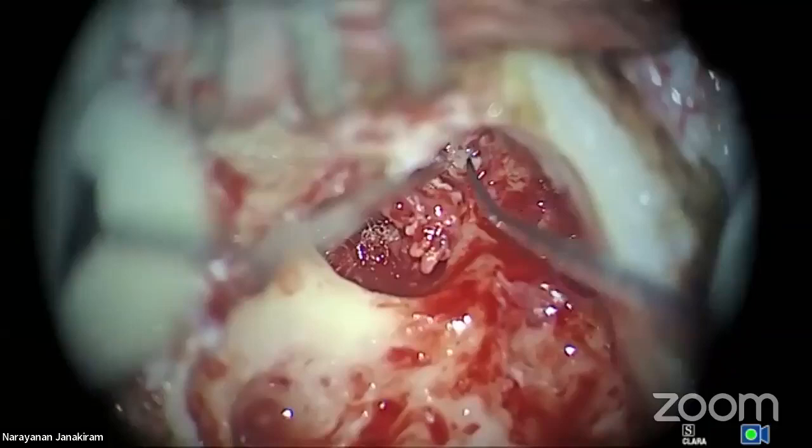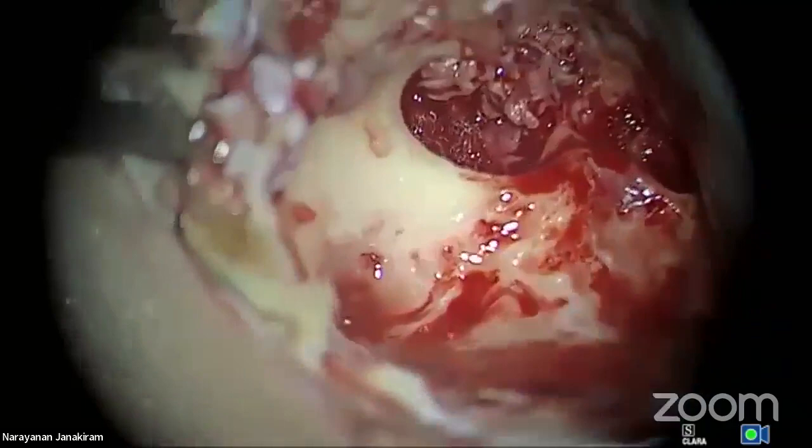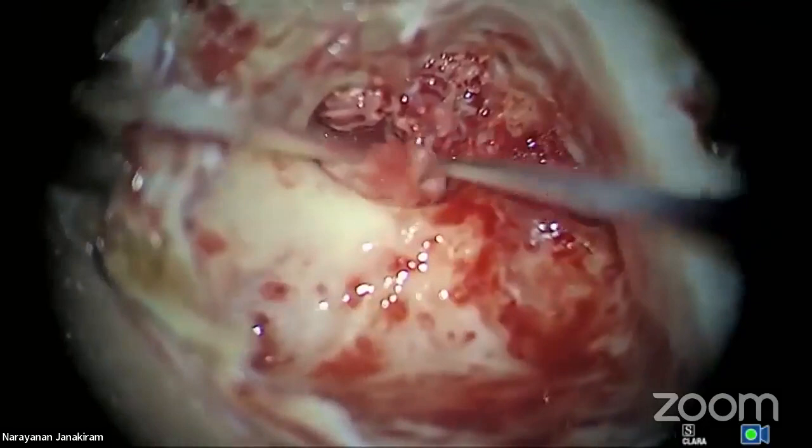See here, I'm opening up the anterior epitympanum. You understand, that's the anterior epitympanum. Can you see here? Now, what I'm going to do, now you go towards, away from you, scissors, give me a cotton ball. I'll place the cotton ball over the foot plate. Normal saline. Okay, good. That's just a normal saline cotton ball over the foot plate.